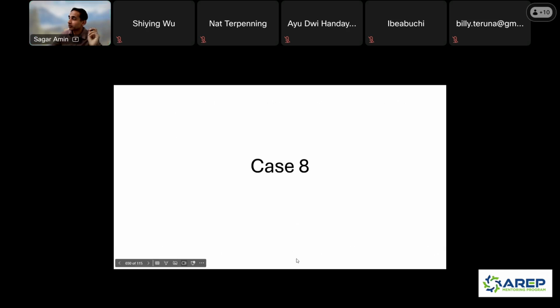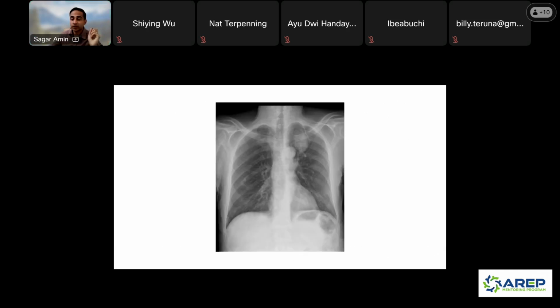All right. So the next case, anyone want to try this one? We could walk through it together. All right, so I'm going to go ahead and get started on this one, and if you want to chime in through the chat, or if you want to speak, go ahead.